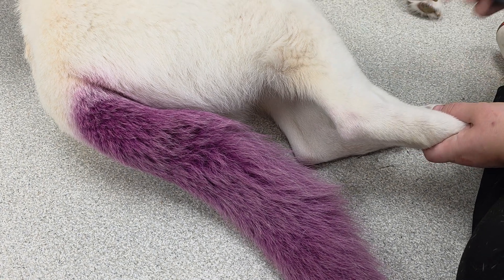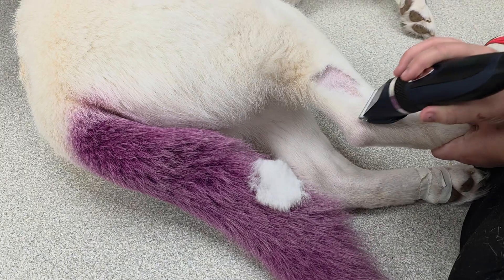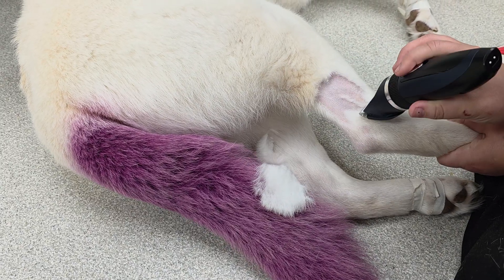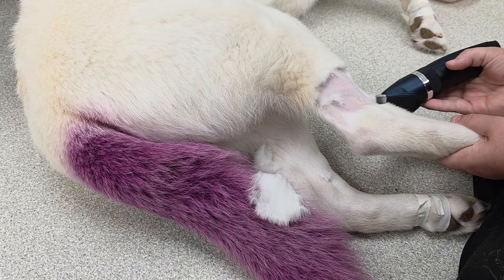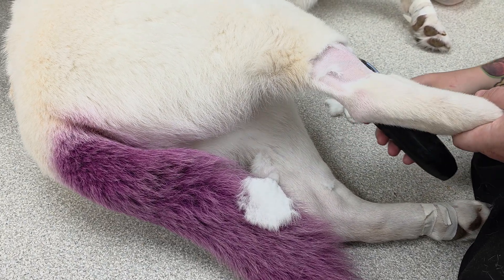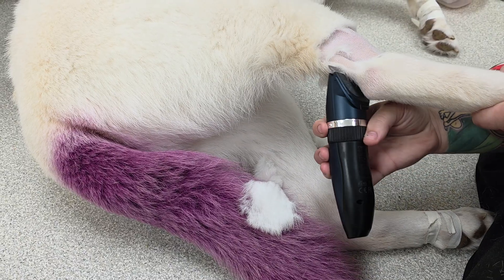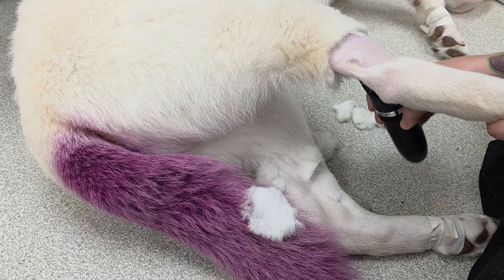We're putting in a back leg catheter on Ghost, so we're going to shave our spot. As we talked about in our previous videos about where the veins run, we're going to shave right where it runs, all the way around to make our tape stick better.